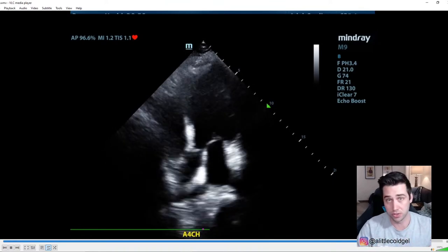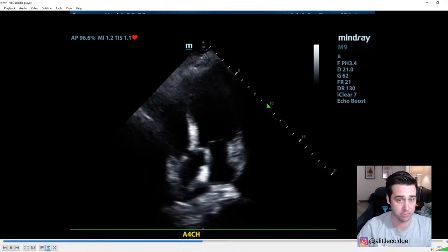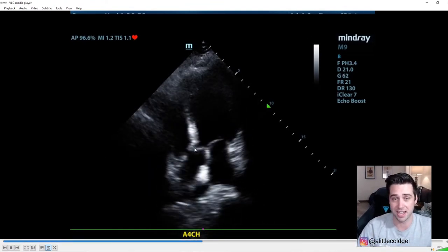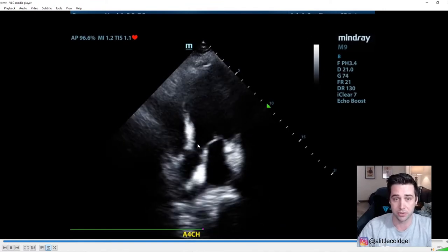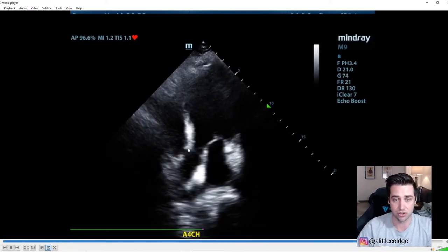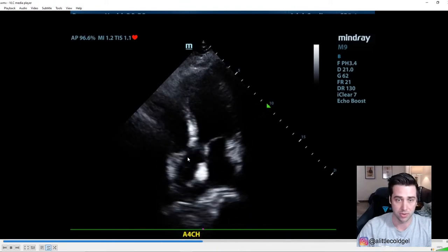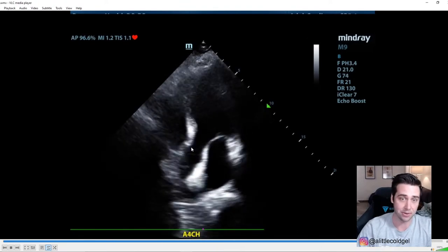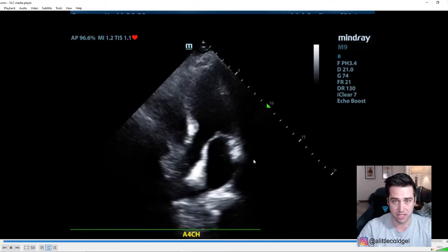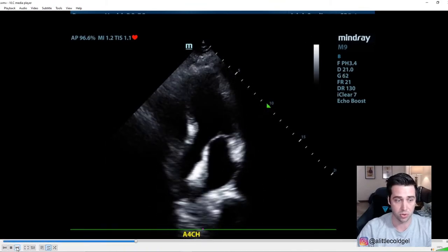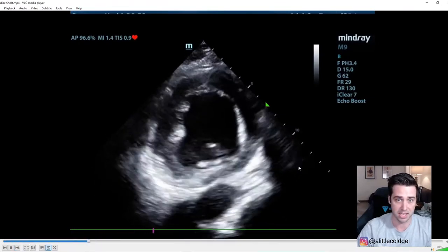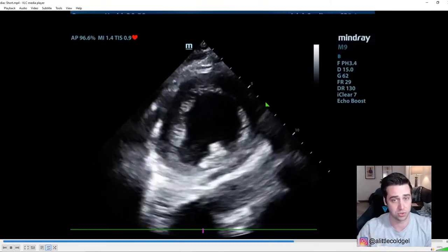This is technically an apical five-chamber view. The fifth chamber is the left ventricular outflow tract — you can see it right here. In a normal apical four-chamber view you wouldn't see that — you'd just see left atrium, left ventricle, right ventricle, and right atrium. If you see the LVOT, you call it an apical five-chamber view. This ejection fraction actually looks pretty normal compared to the parasternal long that looked quite poor.